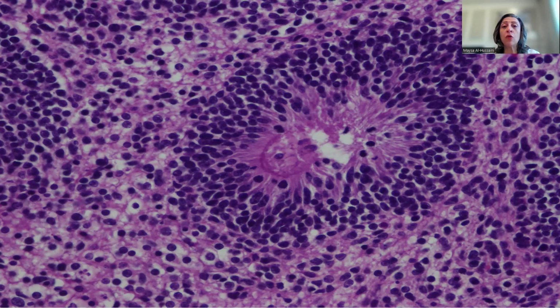And remember that the ovarian tumors are graded according to the amount of the immature neuroectodermal component at low power magnification. So in this case, there were more than 3 foci at low power magnification of the immature neuroectoderm. Thus, the case was graded as a grade 3 immature teratoma.